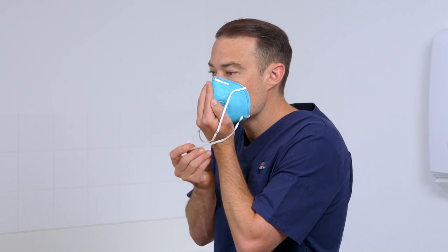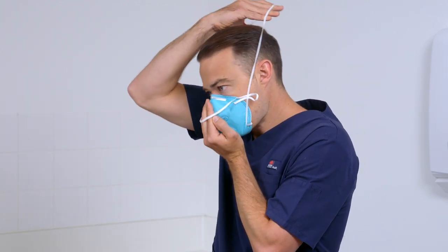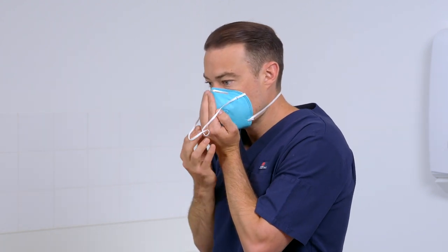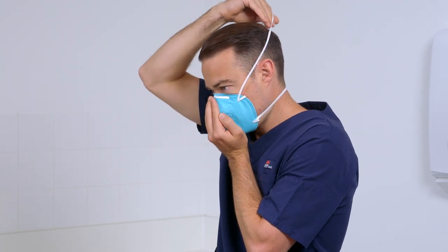Keeping one hand on the respirator, pull the bottom strap over your head then position it around the back of your neck and below your ears. Pull the top strap over the top of your head and rest it high on the crown of your head.